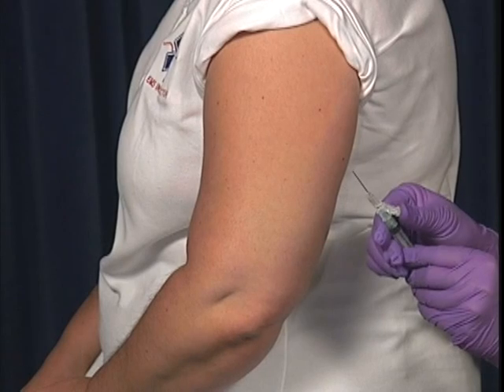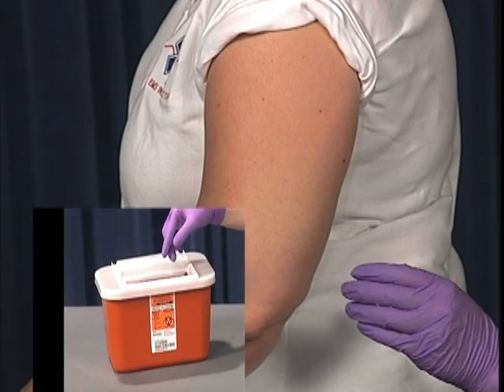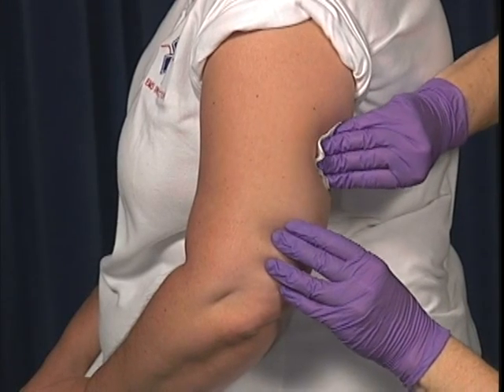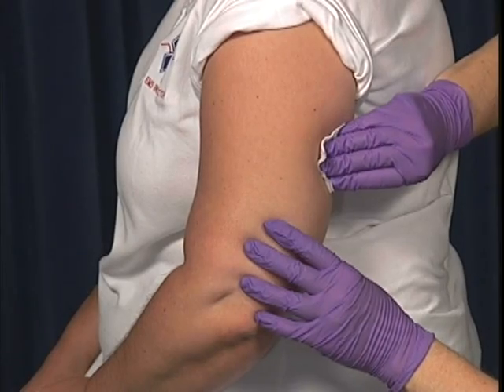Properly dispose of the needle and syringe assembly in an approved sharps container. Cover the injection site with an alcohol or gauze pad and apply gentle pressure to the area to help reduce the pain and improve absorption.